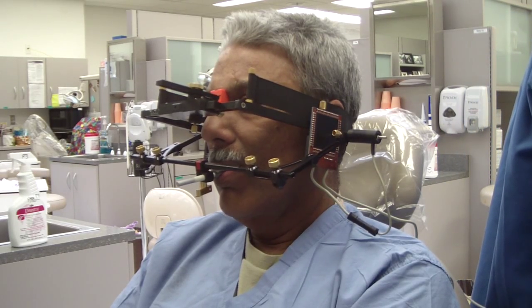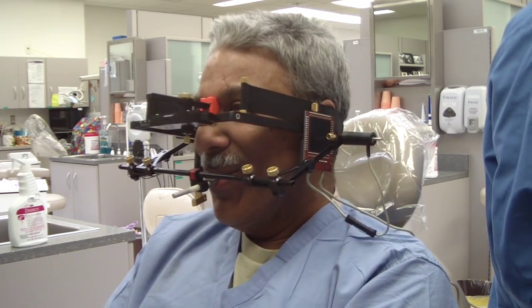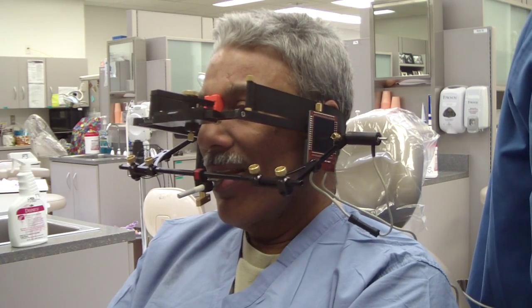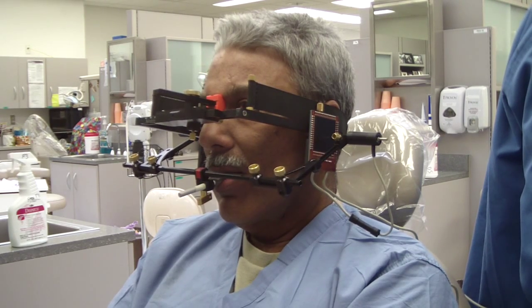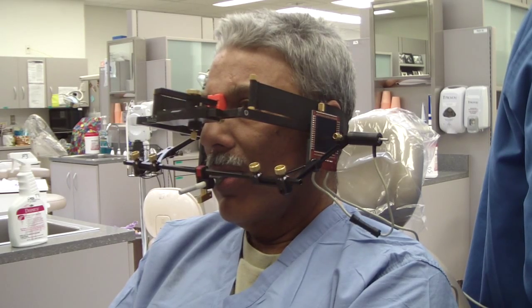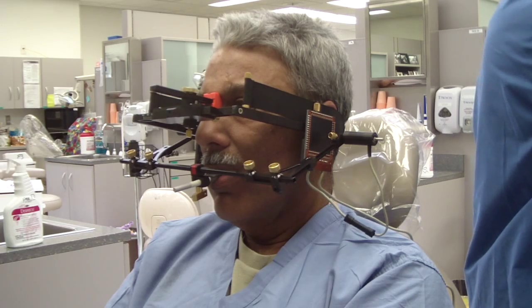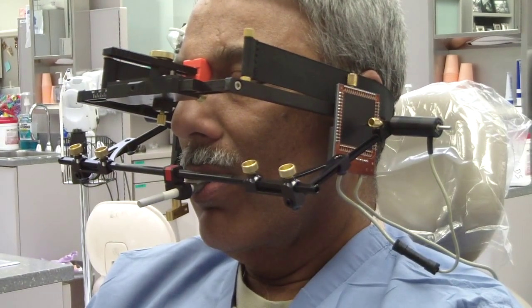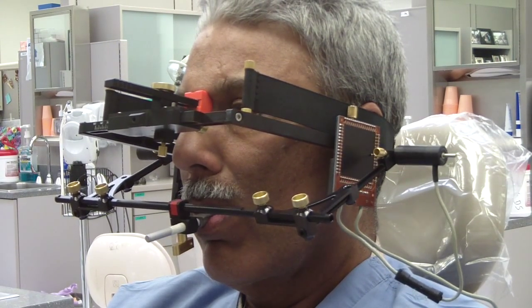Don't be scared folks — my resident colleague is hooked up to a digital pantograph called the Danar Catiax. It's been sitting collecting dust and we figured we'd pull it out. We're using it to record a patient's mandibular movement and then relate that to a fully adjustable articulator.